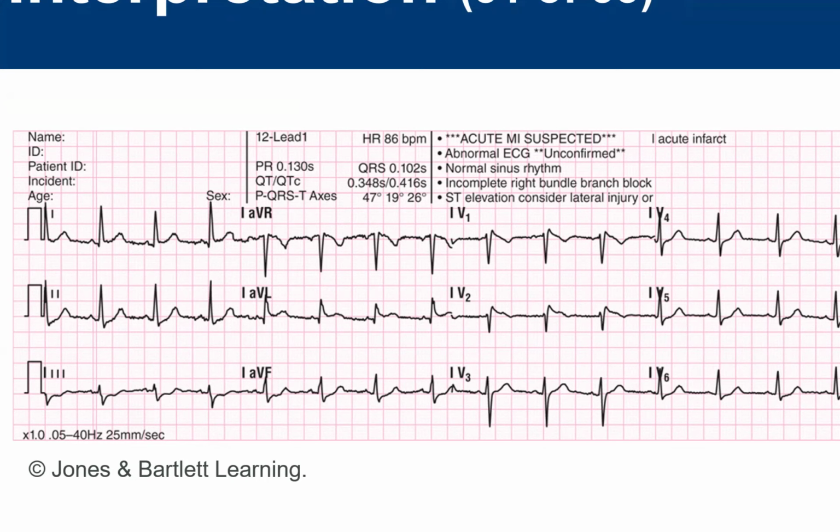We have no ongoing lead there. See that? So all we have is a 3-second snapshot in order across time. 3-second snapshots across time, so we don't have a base rhythm that we can see. We have to take our base rhythm. I normally go to lead 1, 2, or 3, and I try to identify that base rhythm, and I kind of look across the leads.